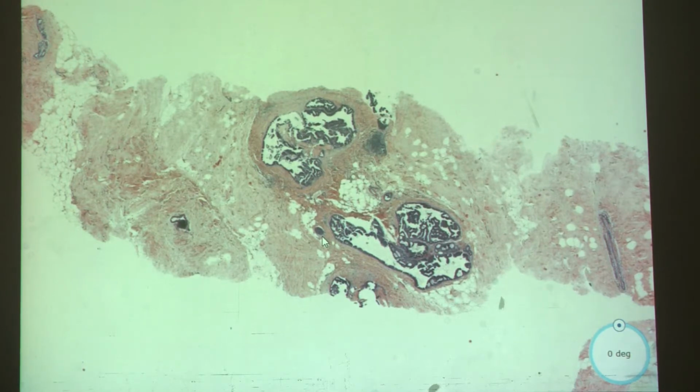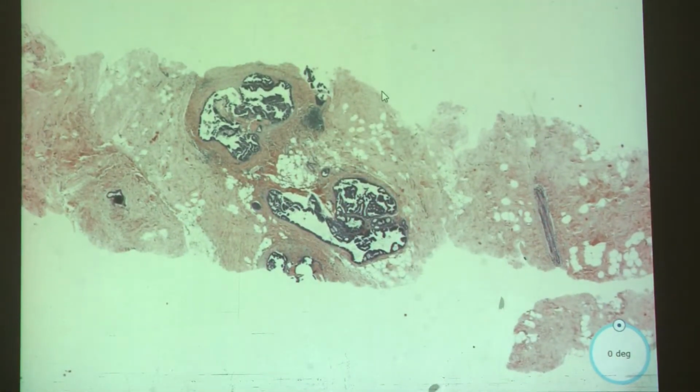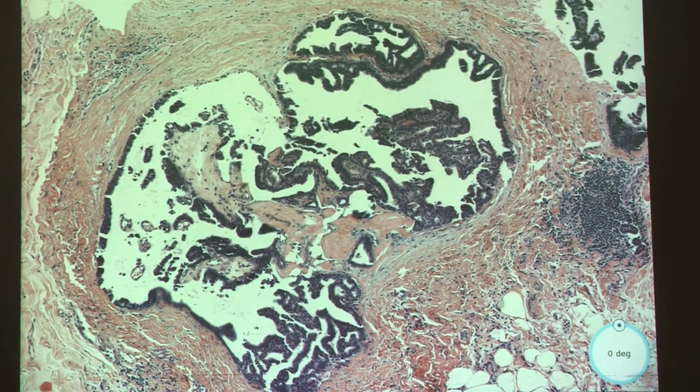You might just have the duct swooping in and out, kind of like how prostate will do that. And they're really close to each other. If it was opposite sides of the core, then I would count those as separate. But this being this close, this is one lesion to me, and you can see here it's going off the core. Okay. So I then think we'll be above the 3 millimeter threshold. So DCIS with papilloma. Yeah. So there's multiple ways to word this. You could say, how would you want to grade this if you're calling this DCIS?